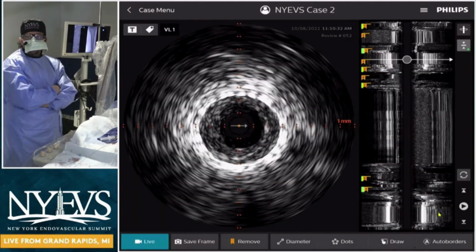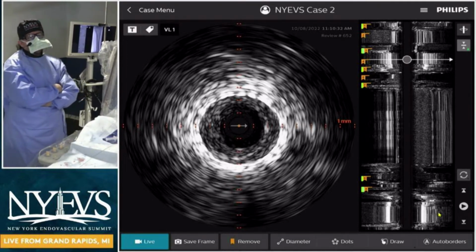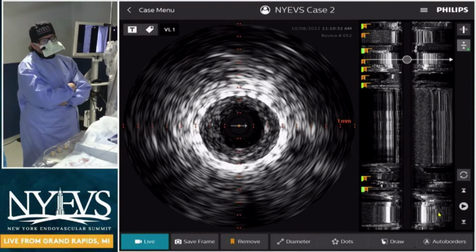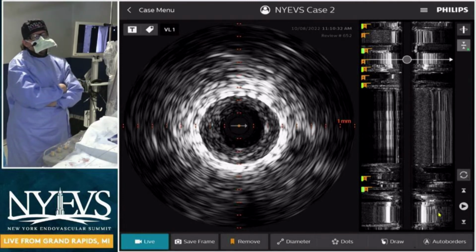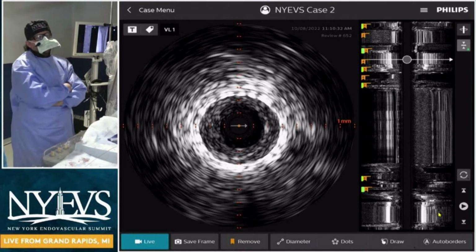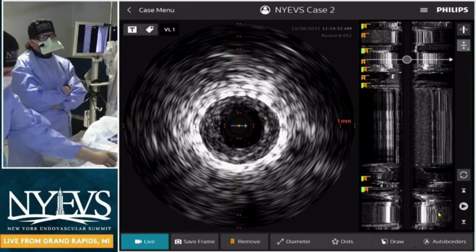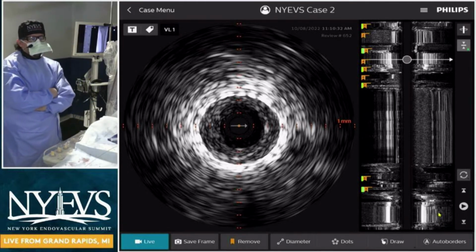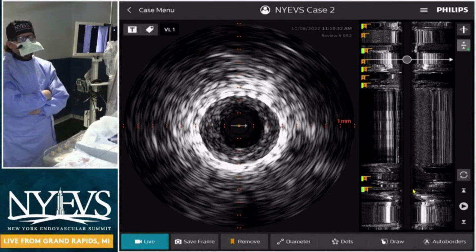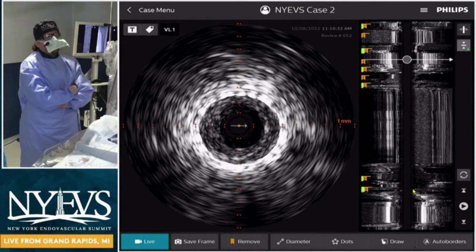Are you guys able to see the IVUS? Yes. So sorry guys, I want to show you. This is the IVUS image after the 2.5 millimeter balloon. The size of the catheter is 1 millimeter. So you have a 1.7 millimeter catheter used with maximum settings, creating a bubble. The one thing I did not do, I wish I did for you guys, is to show you under IVUS. So I'm not really sure why we think that the 1.7 would not do much in this hyperplastic lesion here.